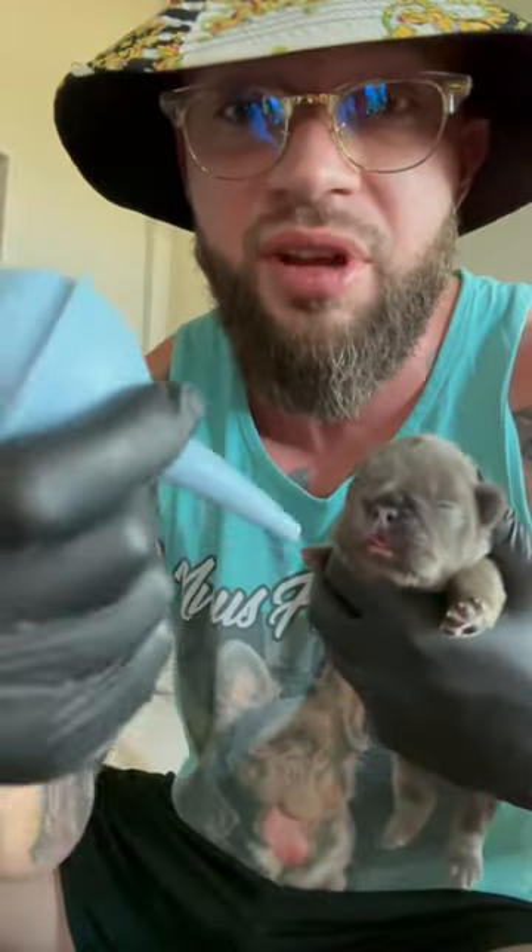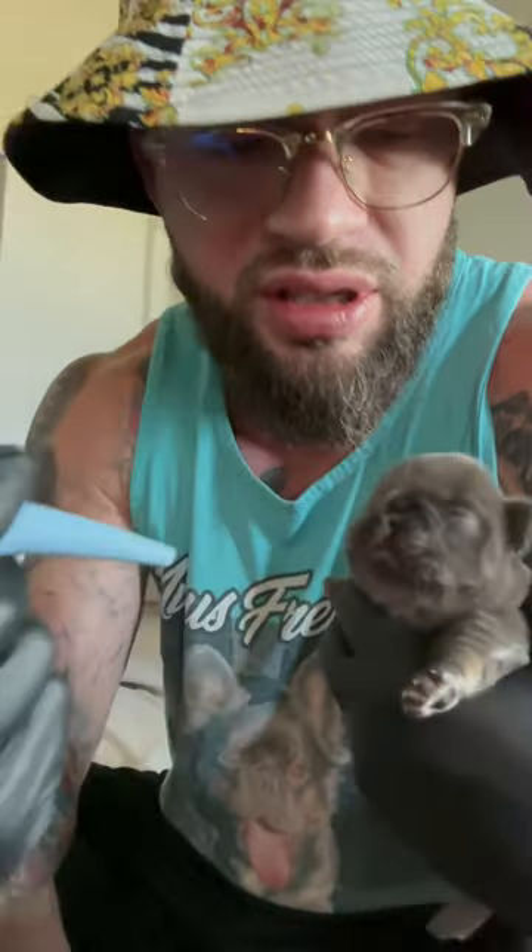Now let's demonstrate. If ever you're feeding and you notice milk spewing from the nose, safely pull the puppy off. Push in the bulb like this, go to the nostril, and suction just like that. Make sure you do both nostrils.